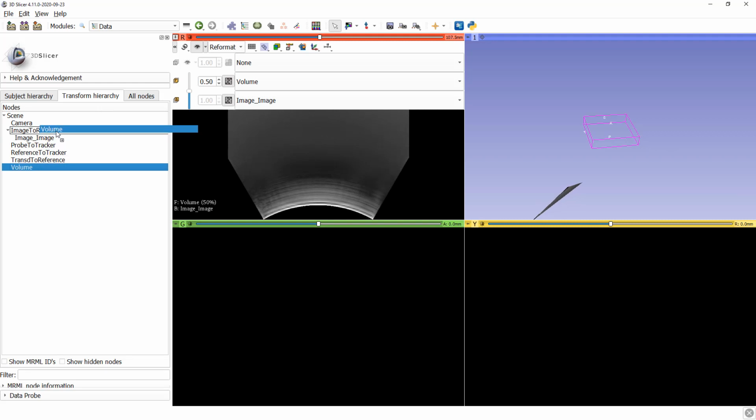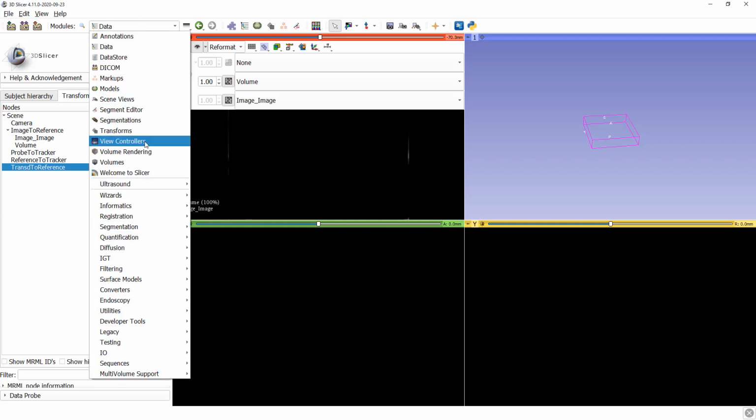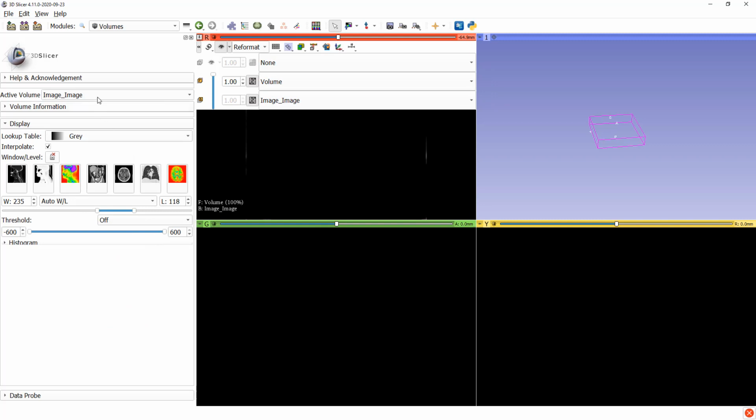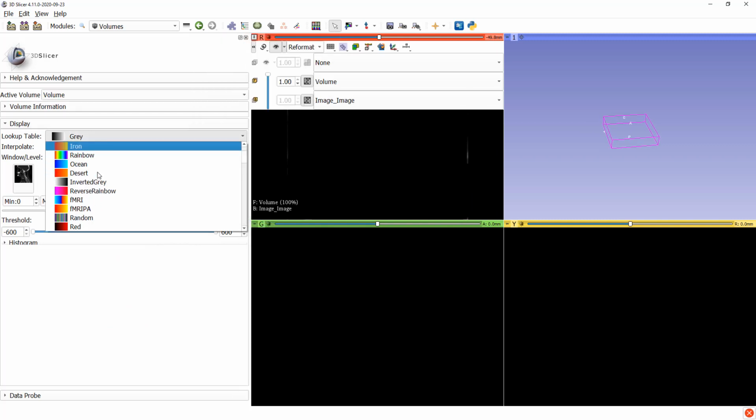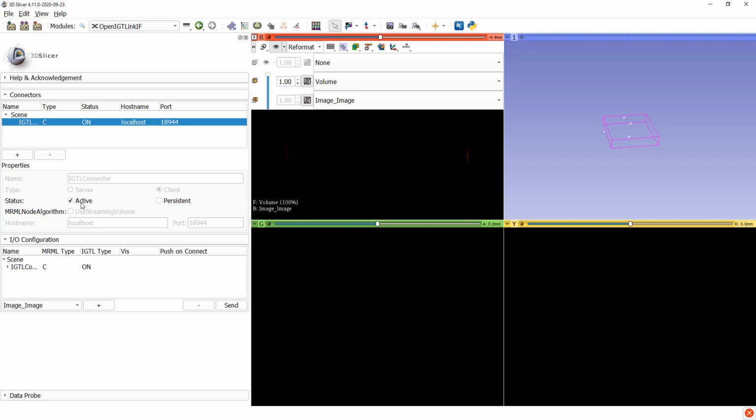Slicer can visualize two volumes at the same time, but we need to transform the prediction volume as well, with the image to reference transform, so that both the ultrasound image and the prediction image are in the same location and we can see them in the same viewer. Here I just scan my arm, a random place, not the spine, so the AI model doesn't do a really good job recognizing my arm bones, but we verified that it's working.